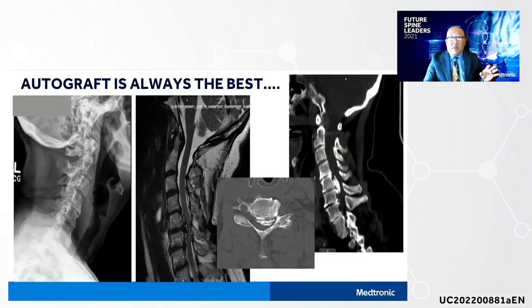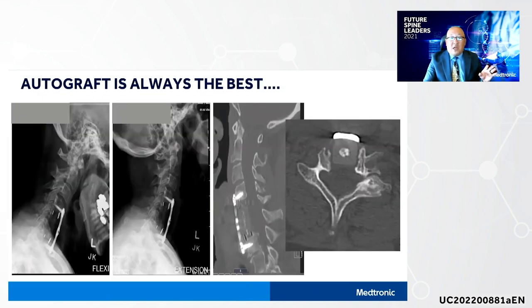Autograft is always your best friend. So in this patient who had OPLL and cervical myelopathy, she underwent a multi-level cervical corpectomy with PEEK interbody spacer and anterior plate, but autograft bone alone from her vertebrectomy site, she's gone on to a solid fusion and is now 5 years out and happy as a lamb.